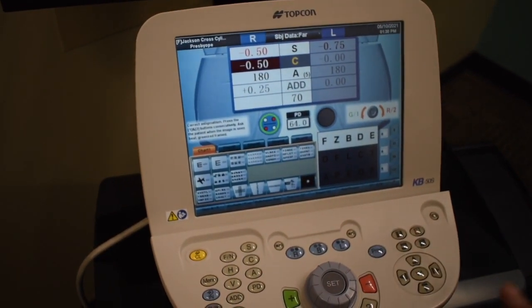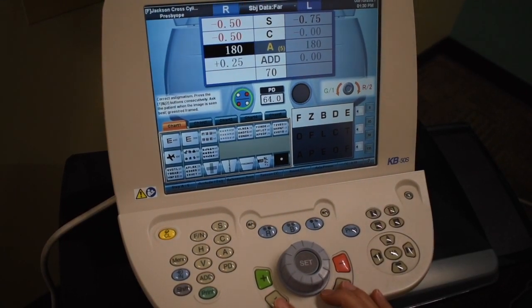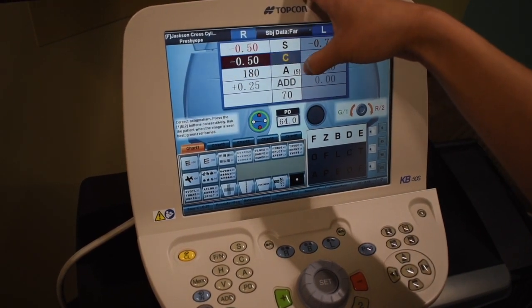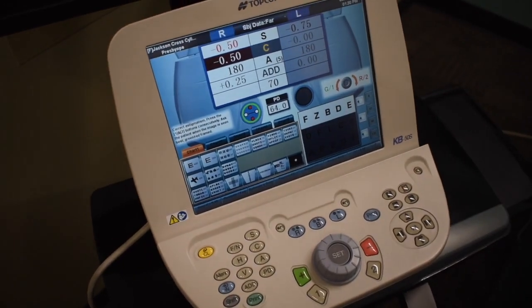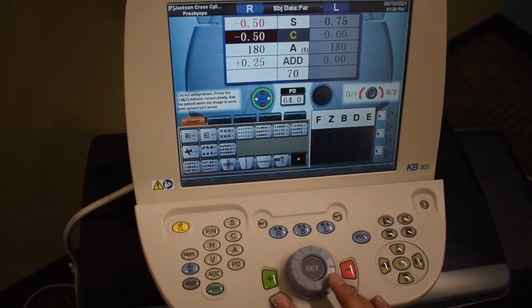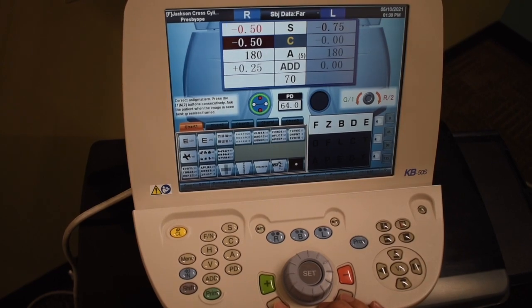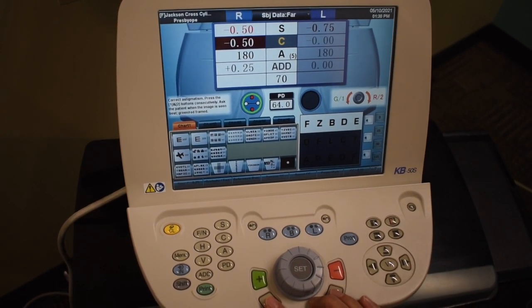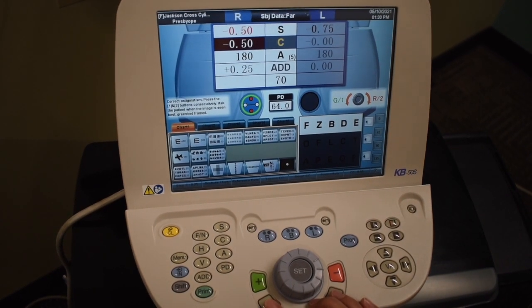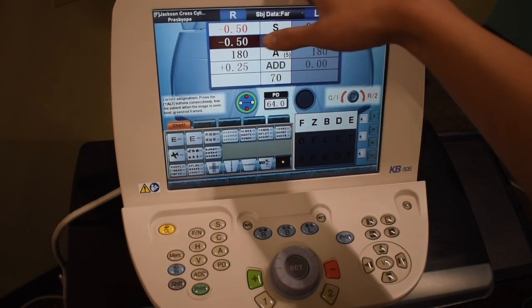Now we're going to move on to the axis. I'm going to give you two options — one or two. You keep going on the cyl until the patient rejects it. So he rejected the cylinder for this part, so we're going to move on to the axis. I'm going to give you two options — one or two. Go ahead and tell me which one makes those letters better. He chose two.